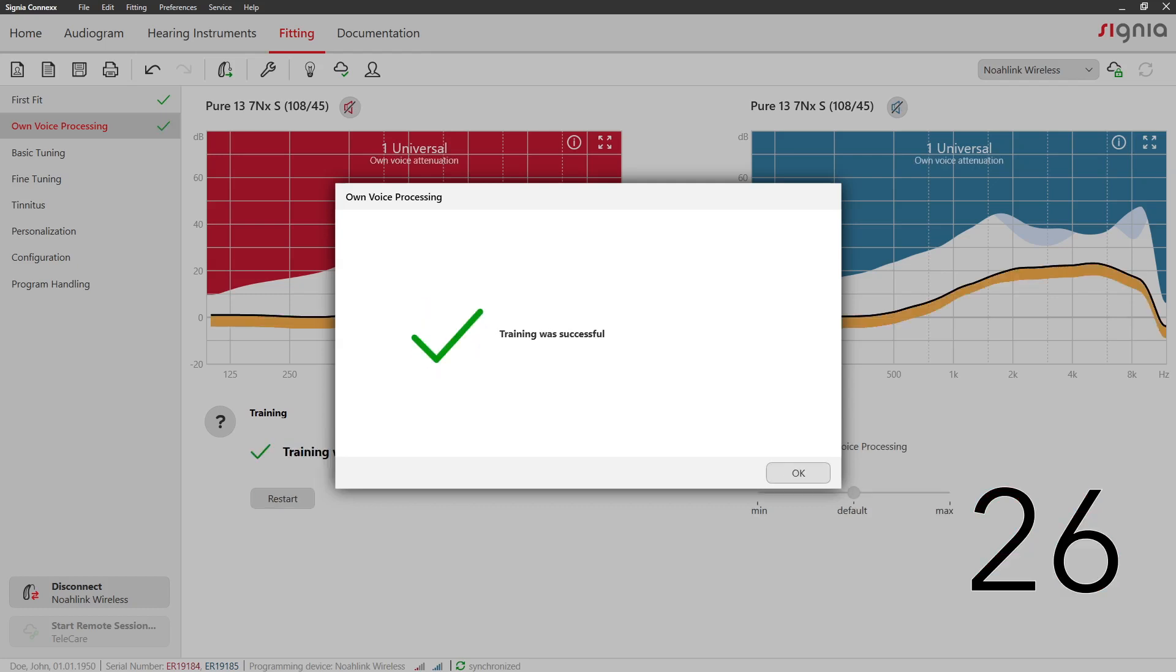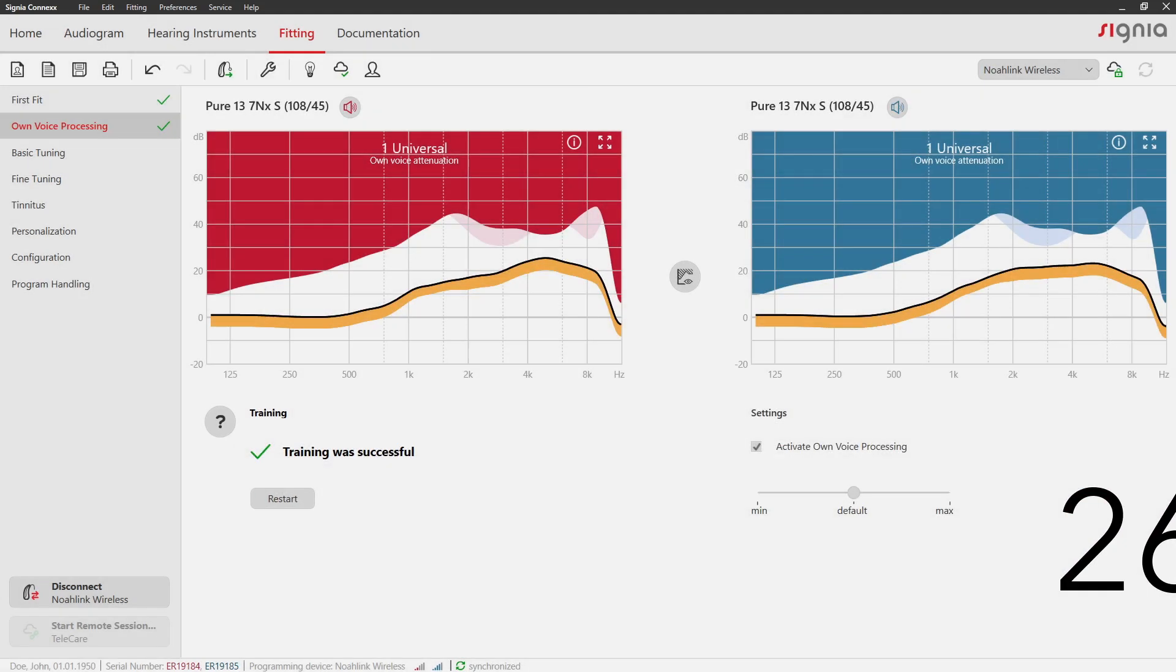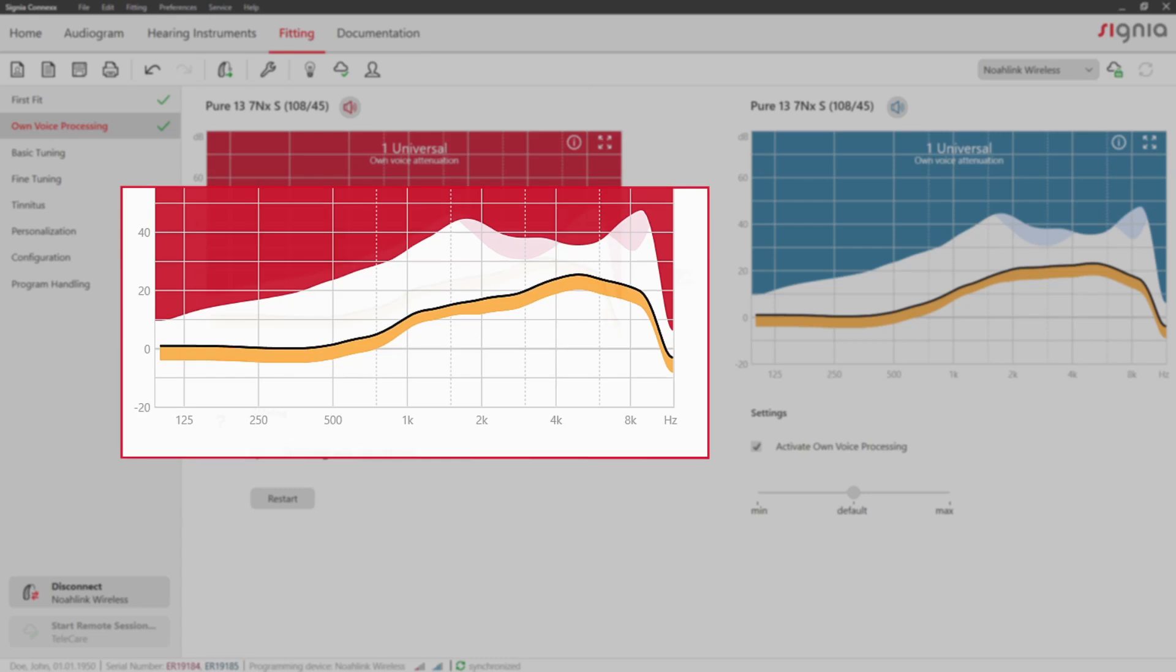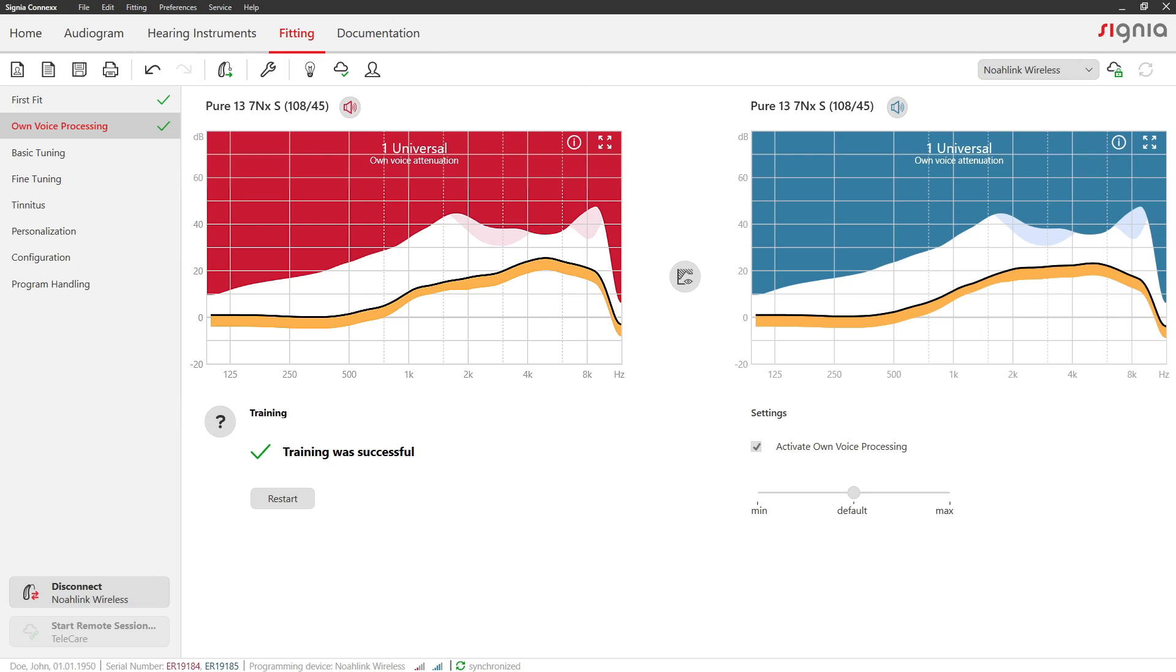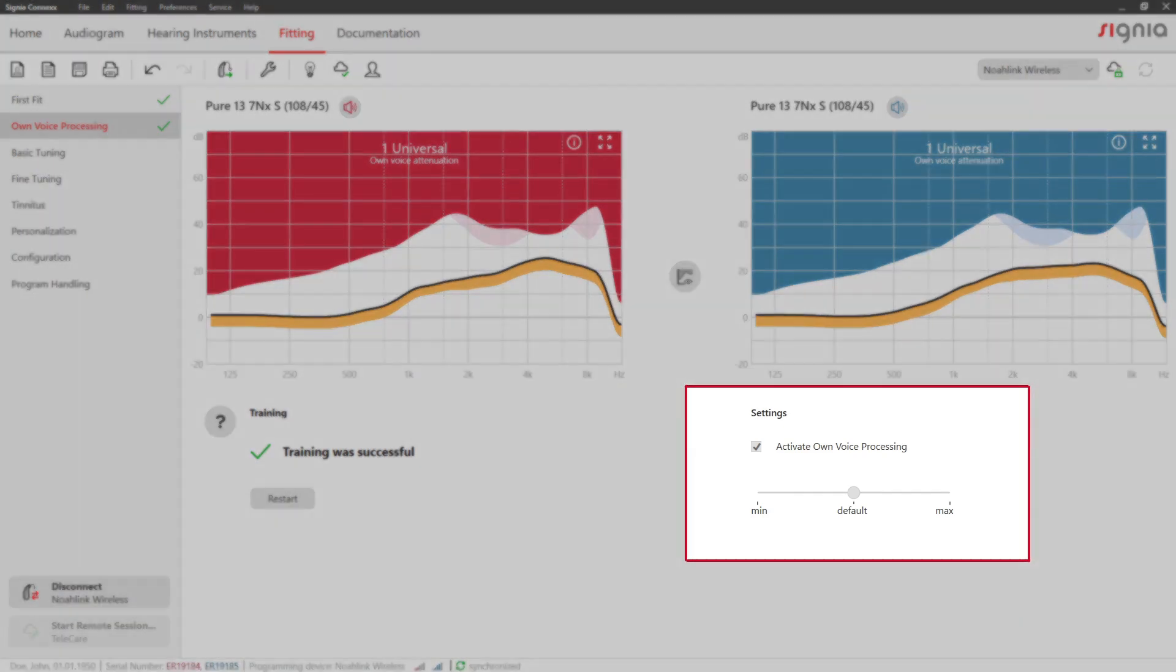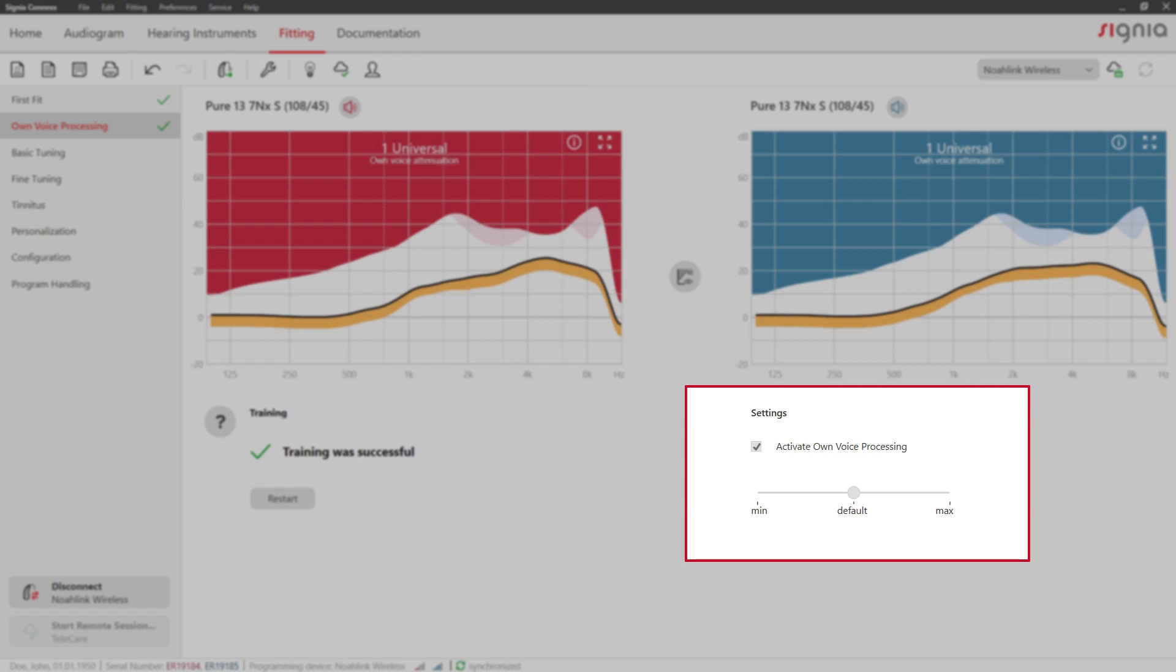The yellow area within the curve view shows you the reduction of gain that is being applied to the wearer's own voice. Finally, you can adapt OVP's intensity to your client's preference if necessary.